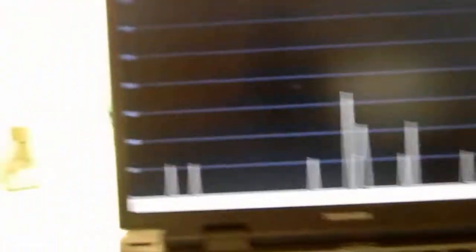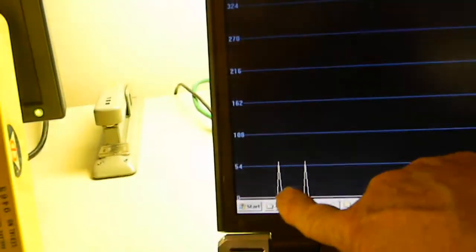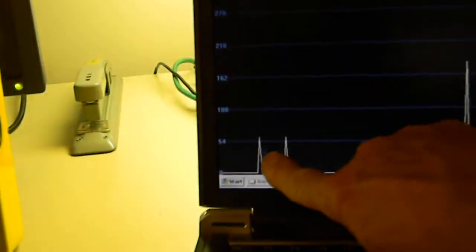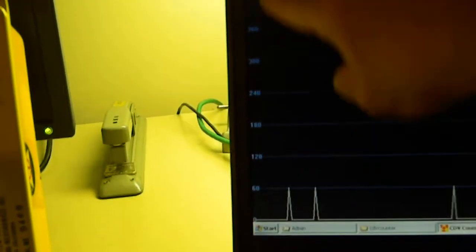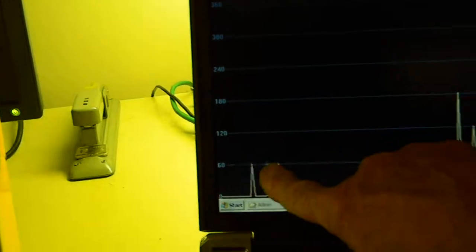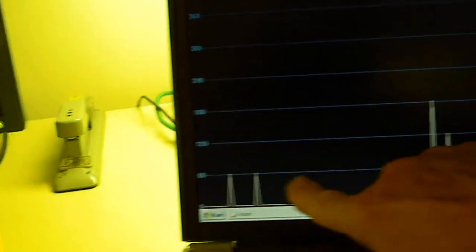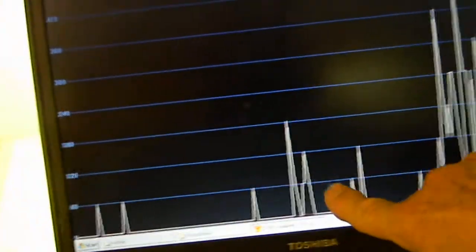You can see the numbers up here. This is 486, 540, and you see the number of pulses. So this was background right here. I'm going to hear 54 counts per minute every so often, and then it started rising as I walked up, and now I'm sitting in front of it right here.